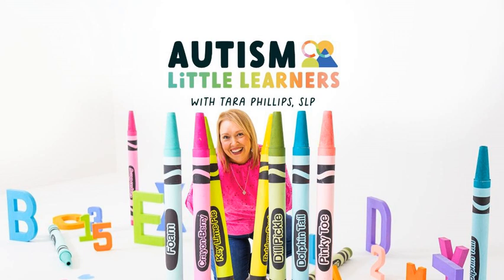The third area is about integrating AAC devices into play and learning. Play is the heart of early learning, and it's also where language thrives. Using AAC in play helps children connect communication with joy, imagination, and shared experiences. Here are a few examples. If you're playing with blocks, you can model big, up, down, crash, help. During dramatic play, model cook, eat, pretend, wash, play. And if you're playing in sensory bins or at a sensory table, you can model look, in, out, fun, again.